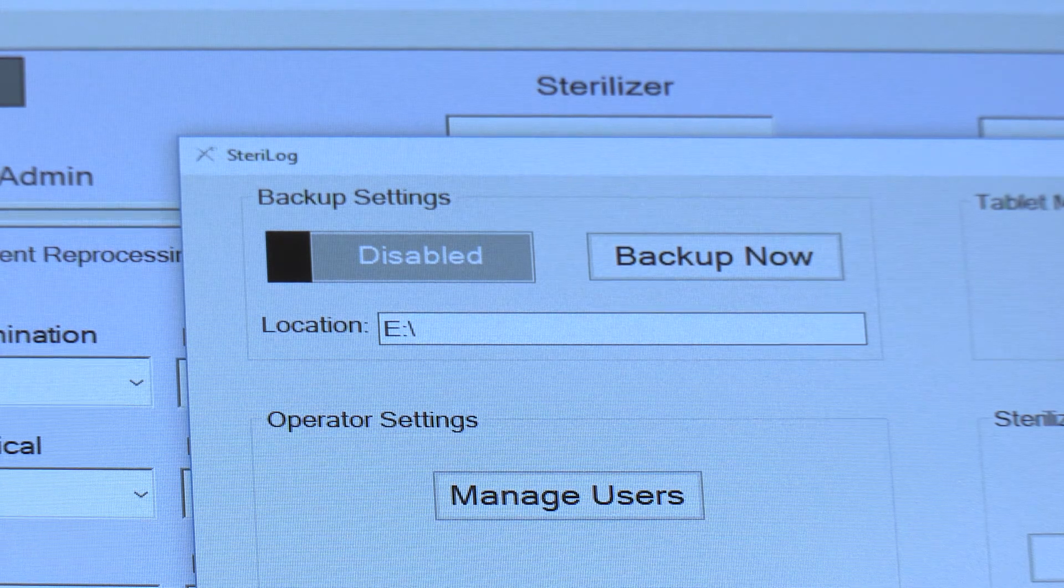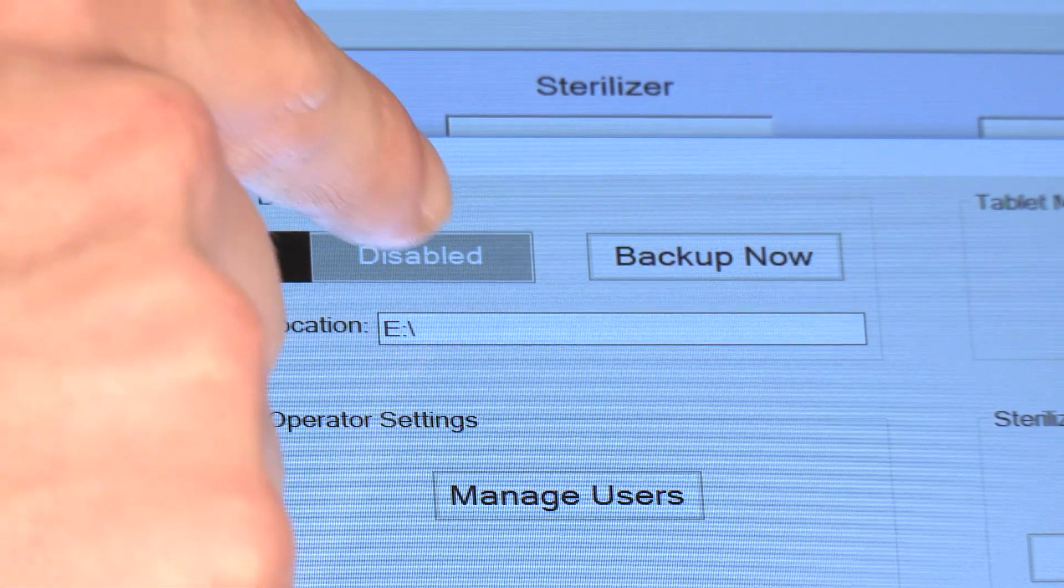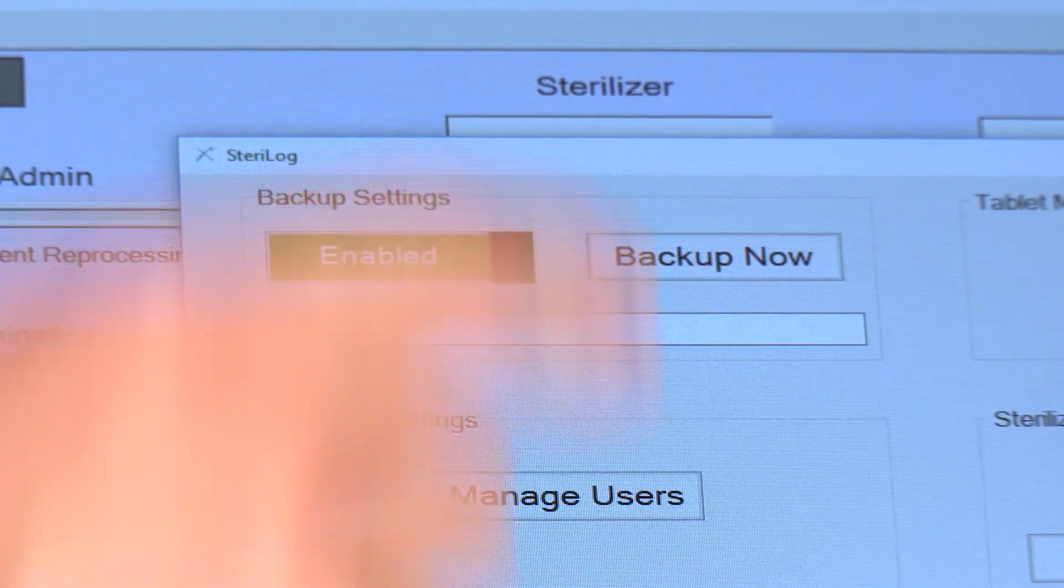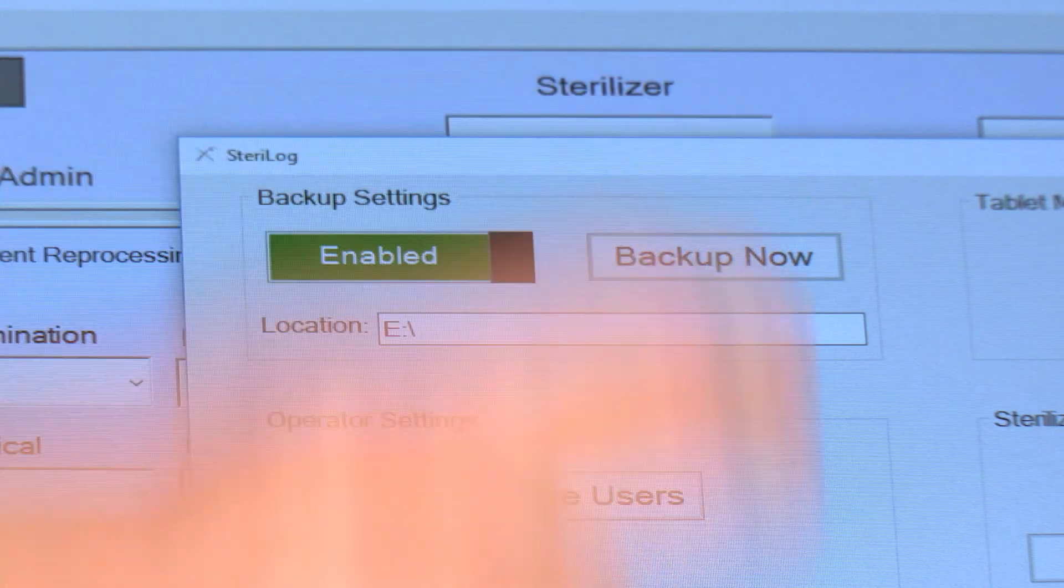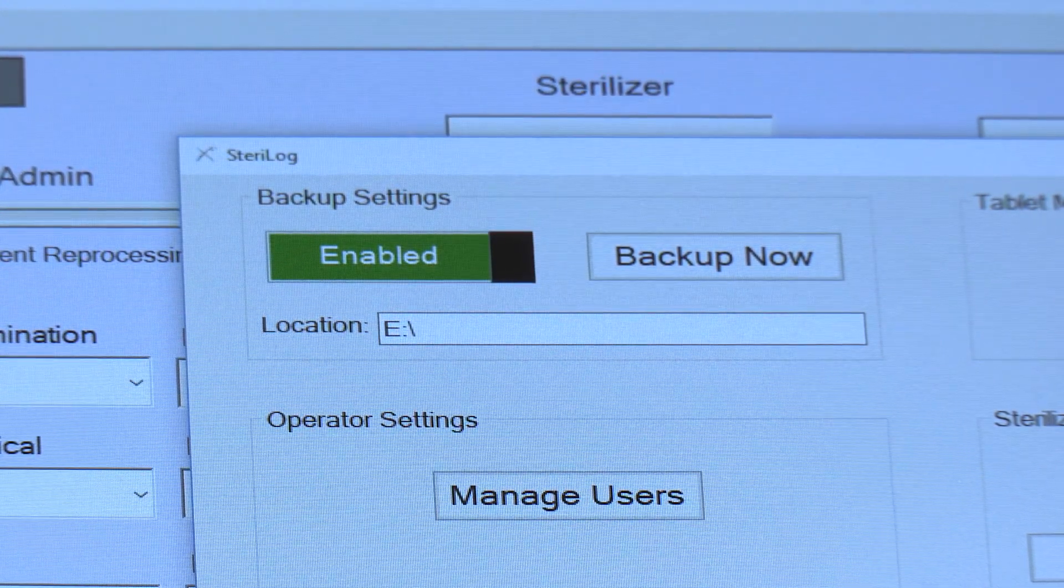After you've selected your backup location, make sure to enable backups and you can hit the Backup Now button to do a manual backup.